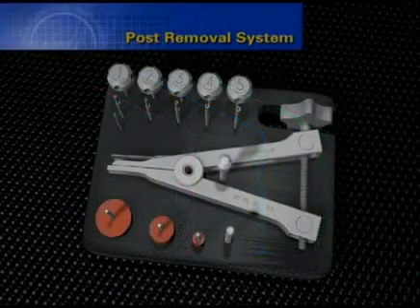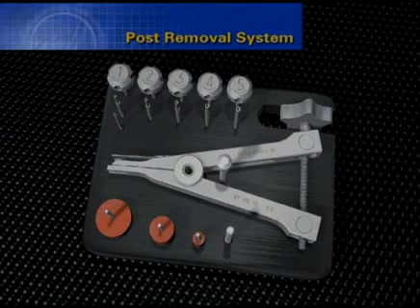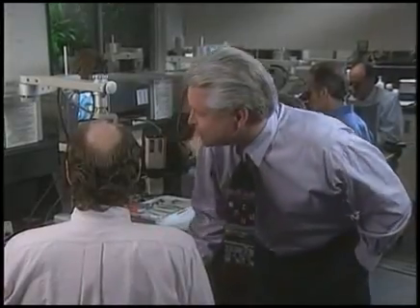The Post Removal System kit is a device that can mechanically engage any obstruction whose cross-sectional diameter is 0.6 of a millimeter or greater. The PRS kit contains several component parts, which we will look at a little later in detail. These are the basic devices you will need for most post removal cases. The more specific instruments will be discussed in each material segment. So now that we have the general picture, let's roll up our sleeves and develop our game plan for post removal.